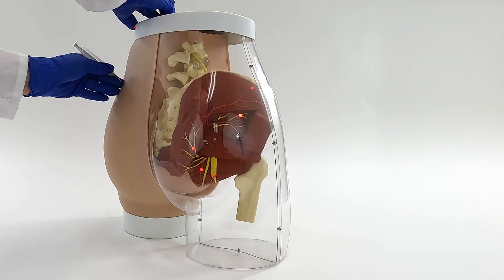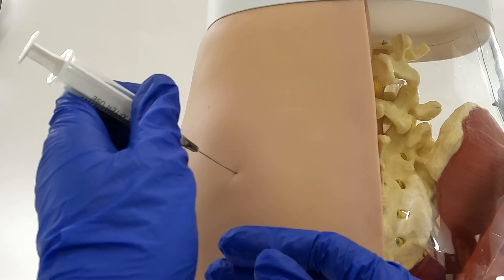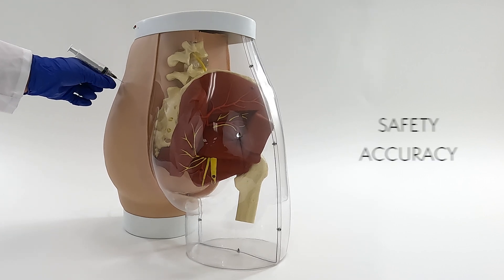With this advanced model, students can hone their skills in performing intramuscular injections in the gluteus muscles and achieve precise needle placement to avoid the sciatic and other important nerves, ensuring the safety and accuracy of every injection.